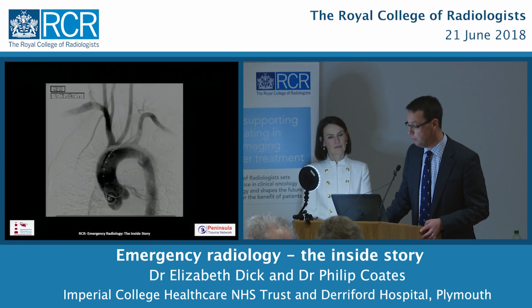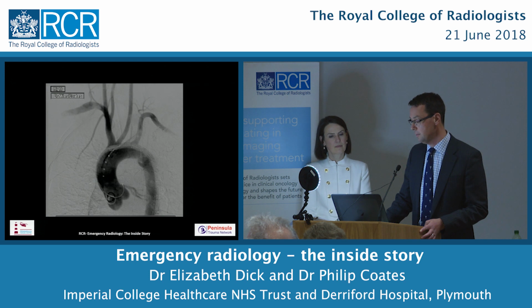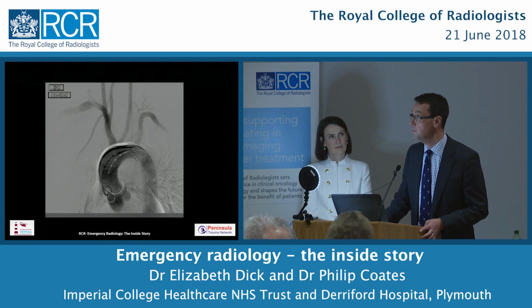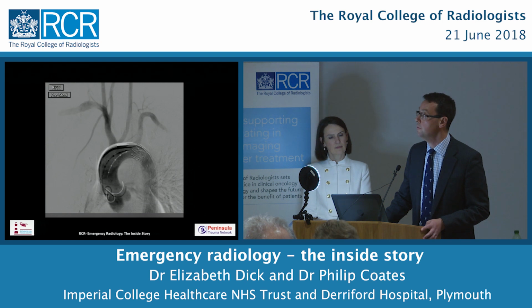Okay, so this is before we've deployed it. I did this with my colleague, Dr. Richard Miles. And the vessel on the left there is the left subclavian. In this case, we want to not cover that to maintain the blood supply down his arm. And we've released the stent graft there. The first centimetre or so is uncovered, but the rest of it is material, and that's going across our pseudoaneurysm.